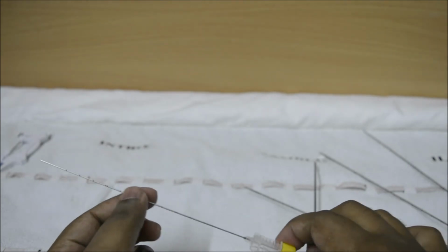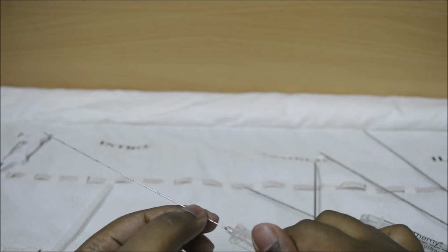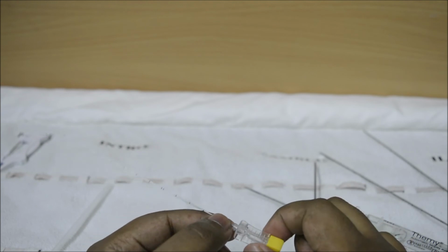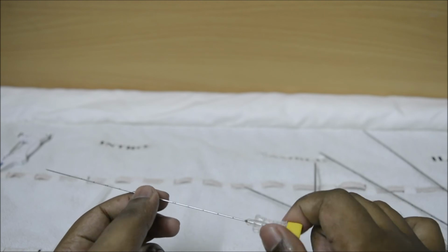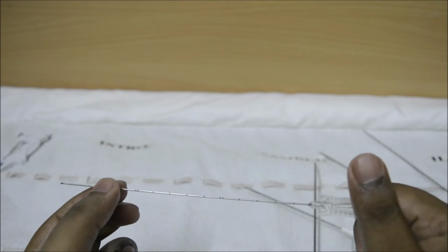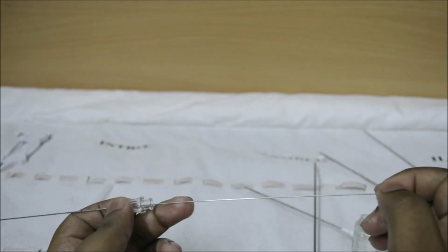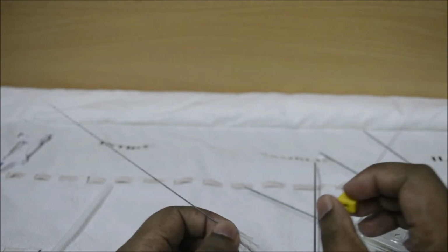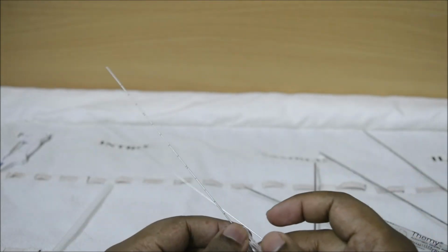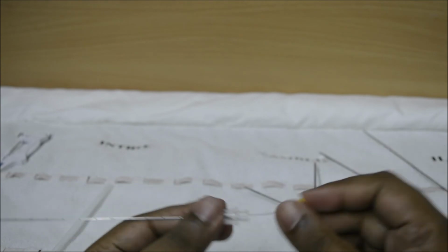So these needles are basically very fine, and they are used to collect any form of special fluids from the lymph node or the body, and that small amount of fluid is used for testing. These needles also have echogenic markers, so this can be inserted in the body, and the stylet part comes out and the cannula remains. So the procedure remains the same. So this is how fine needle aspiration cytology is basically done.